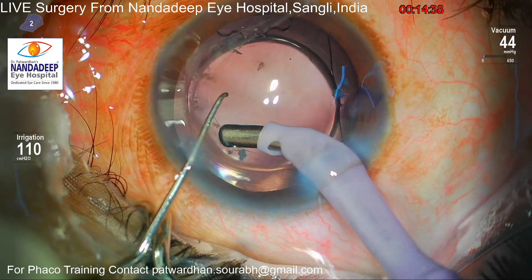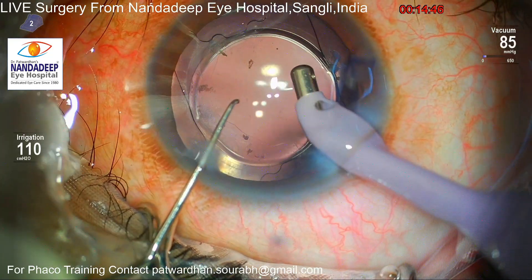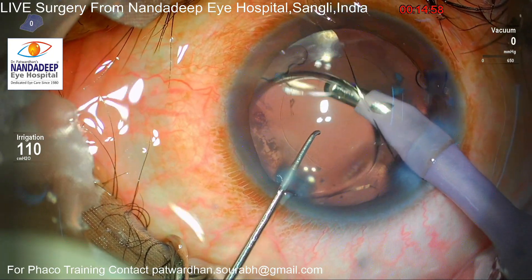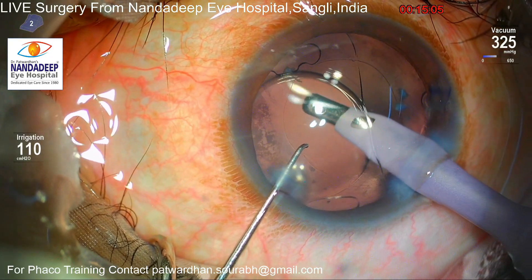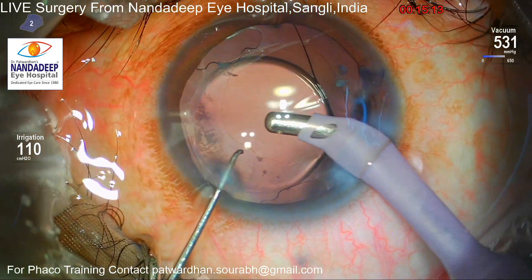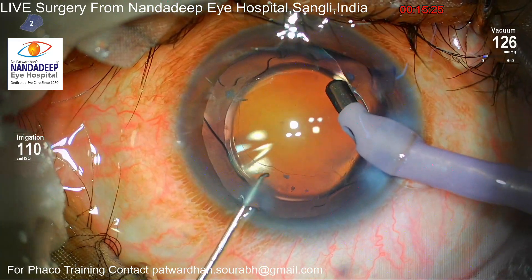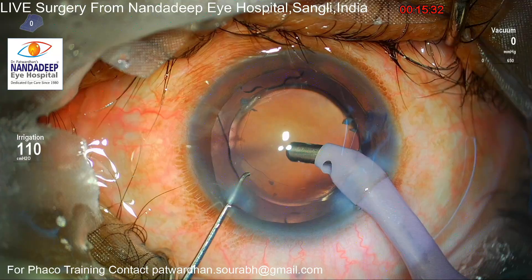What I do is gently nudge the IOL to one side, go underneath the IOL, and try to flush out the viscoelastic from the bag. As expected, the CCC on one side is slightly smaller, but the CCC is well covering the optic all around, so I don't want to disturb the CCC any further. And this is the way I wash out all the OVD from the bag.